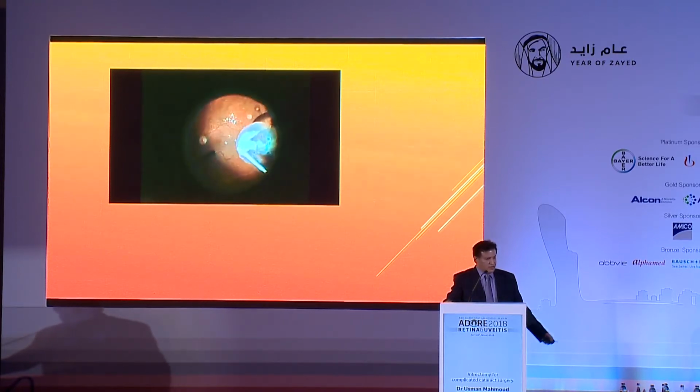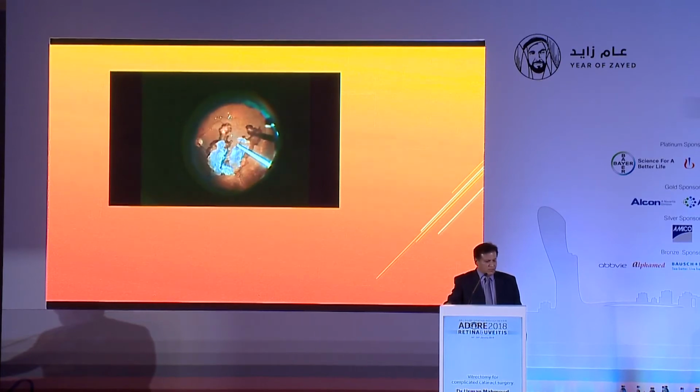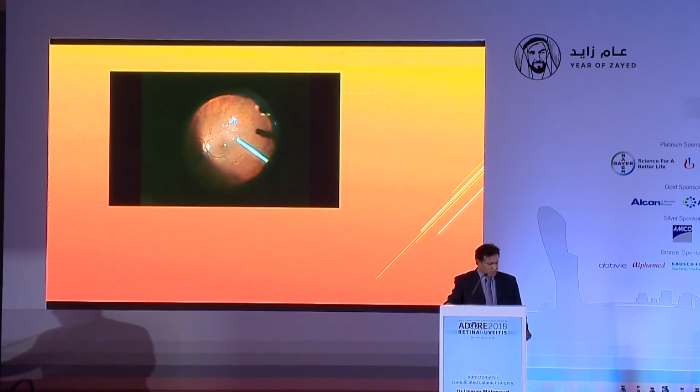And then, as Felipe mentioned, the crush technique. So you hold the nucleus, crush it into pieces, and then you just have to be patient, and ultimately you remove all the nucleus safely and efficiently.